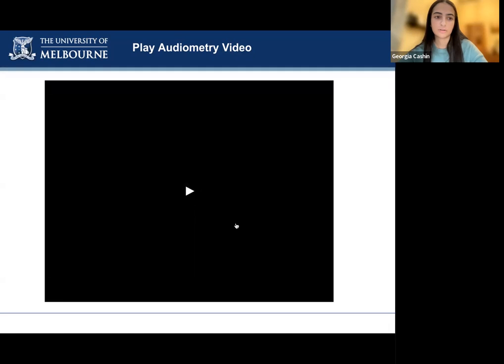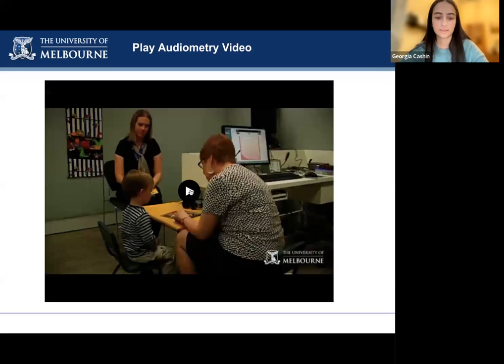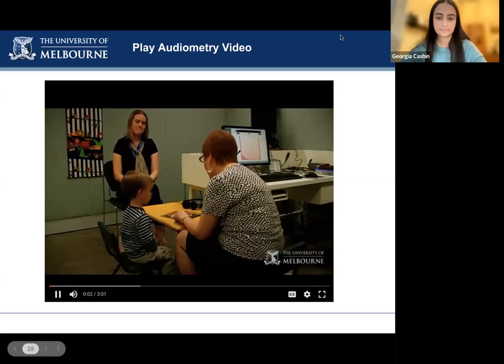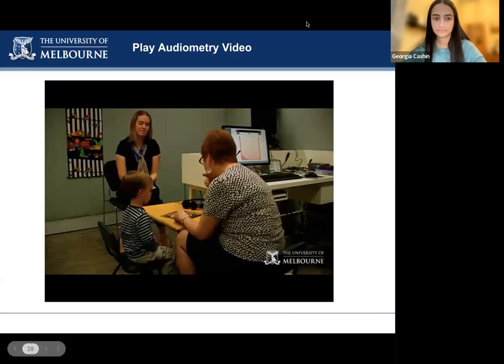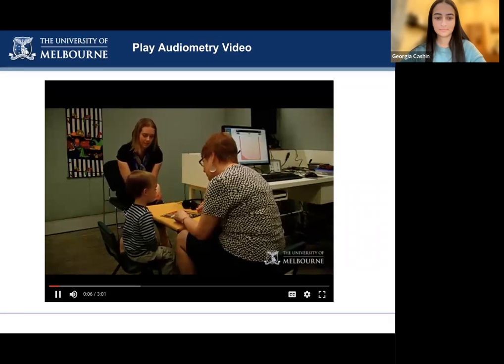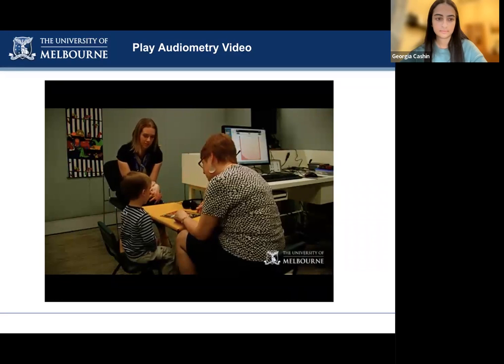We now have a short video demonstrating play audiometry from start to finish. With children, it is vital to establish a good rapport from the outset. The audiologist then begins training the child to perform the listening task.